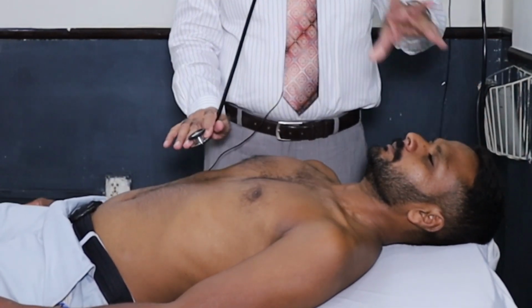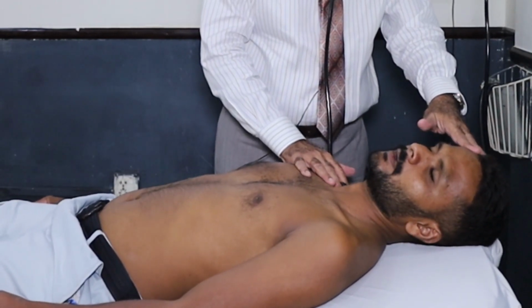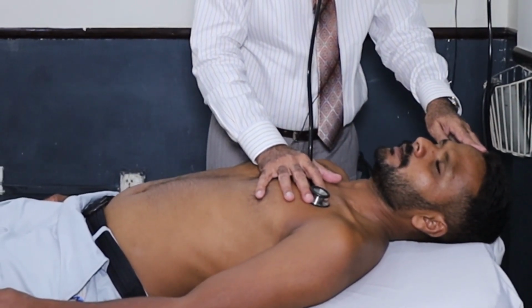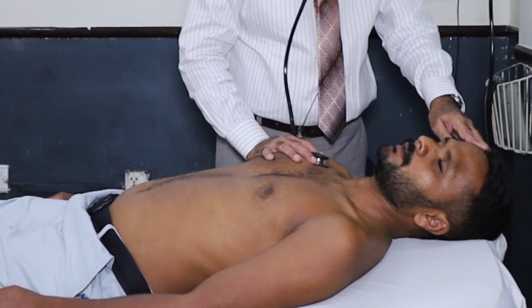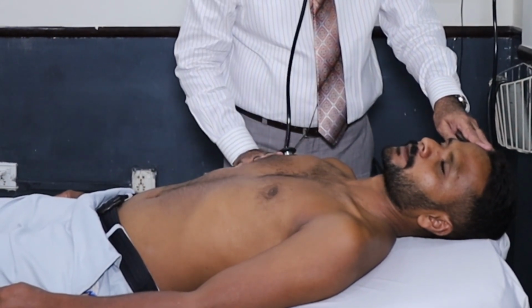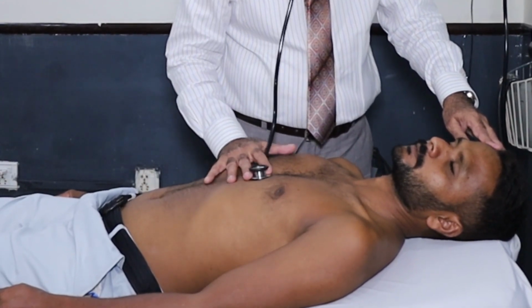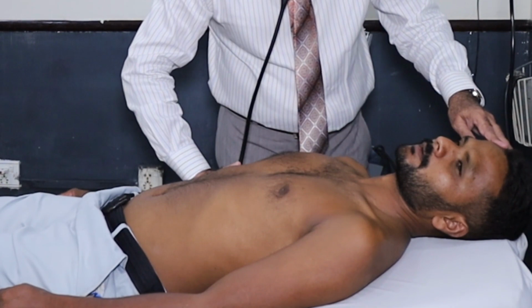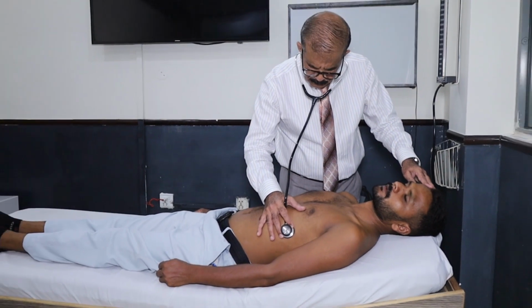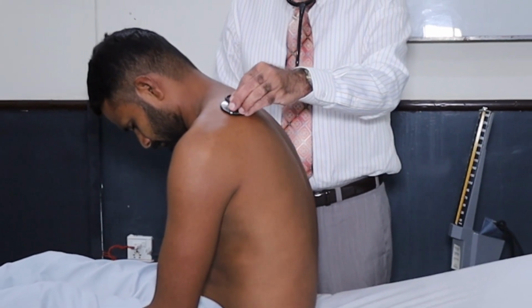You should auscultate one area for at least one whole respiratory cycle. Then the other side. Okay, breathe in. Once the front side is done, I'll go to the back and then again auscultate both sides.